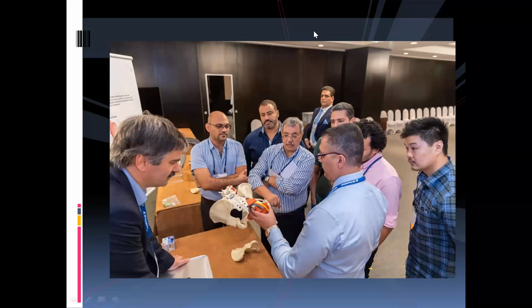Yes, the divergent cup question. When you have a divergent cup, you will have a hemispherical, not an oval shape. This is the aim.